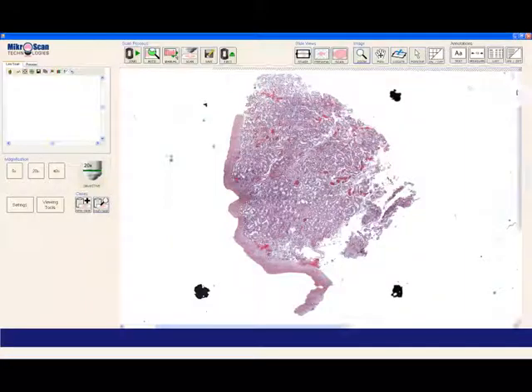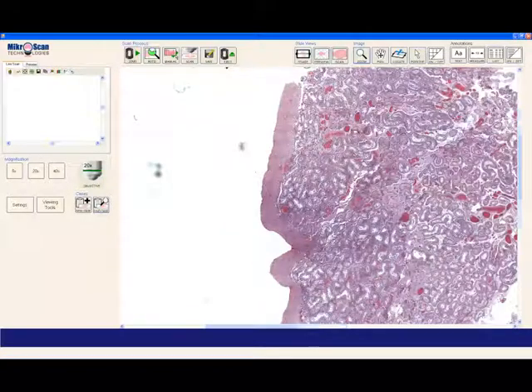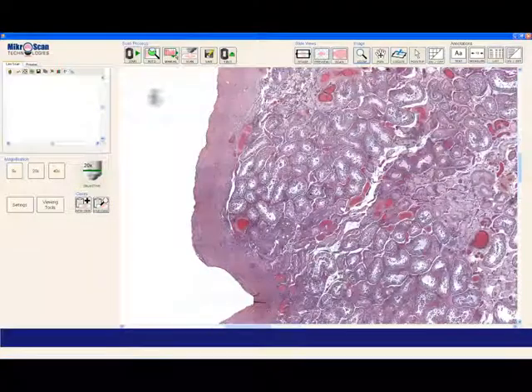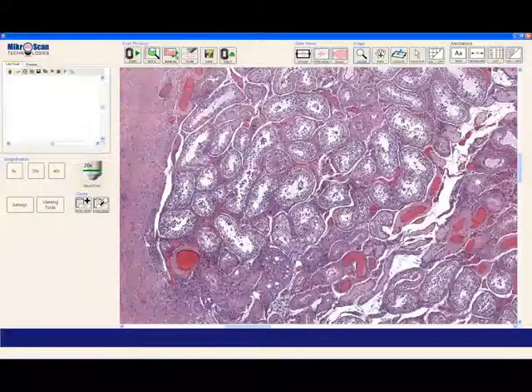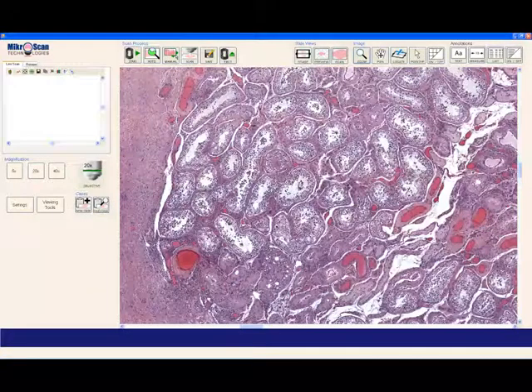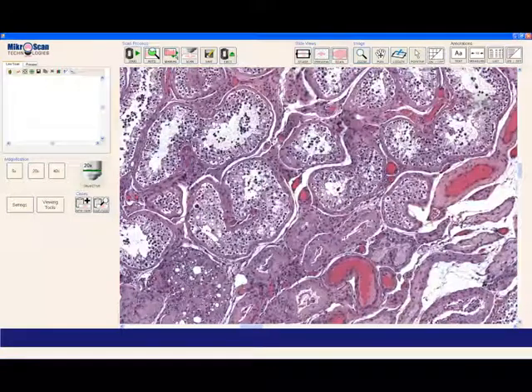The most basic of all the viewing tools is the Zoom button. This allows you to go from the lowest to the very highest magnification with simply a click.